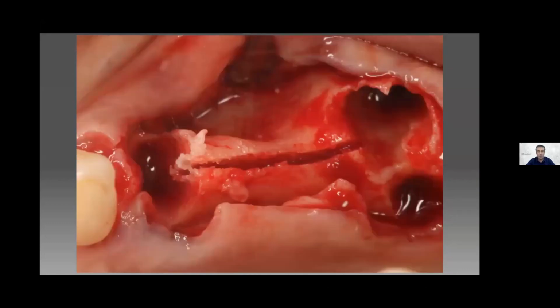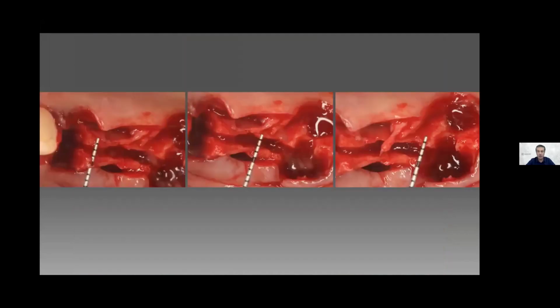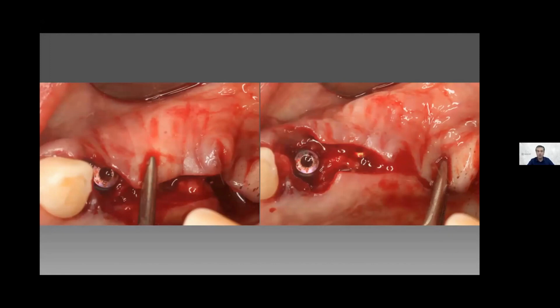This is during the procedure, the splitting technique procedure. Here, after enhancing the space, and here, after placing the 3 implants, no buccal bone, but here it's nothing, it's a one wall defect, only the buccal plate was absent. So after all that we do, it's very important to do the periosteal incision, the mucoperiosteal incision. Why? To eliminate all the muscle from the periosteum and to let the flap free. So we will close after our guided bone regeneration.